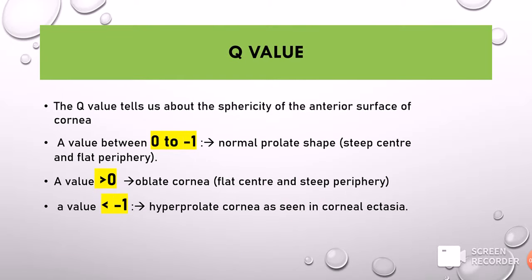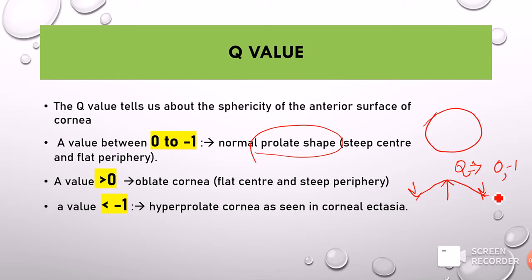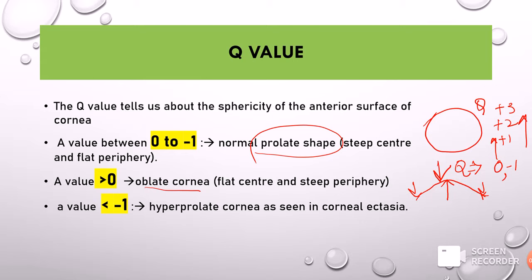Then we have the Q value, which talks about the sphericity of the anterior surface of the cornea. The cornea is not a perfect sphere; the central part is steeper compared to the peripheries, which are flatter. The normal cornea has a Q value of about 0 to minus 1 — a prolate shape, meaning steeper in the center and flatter in the periphery. When the value is more than 0, going to plus 1, plus 2, plus 3, it becomes an oblate sphere.